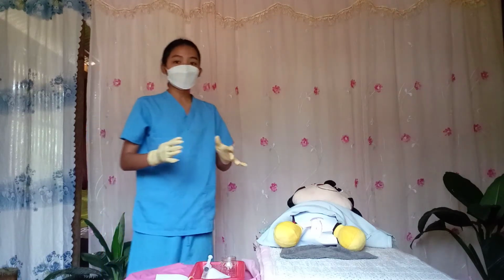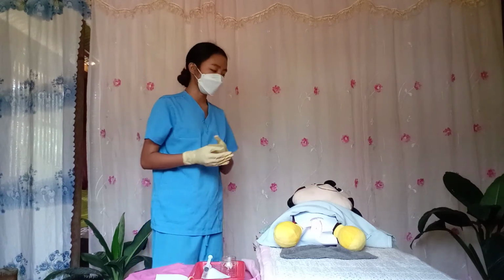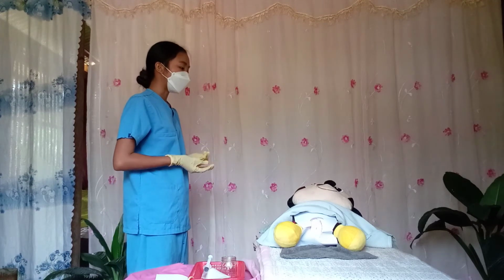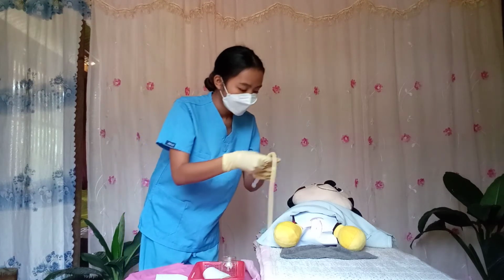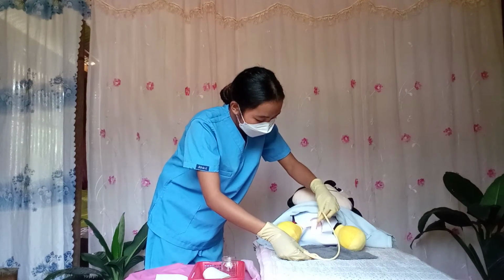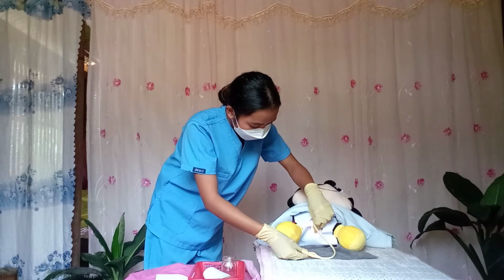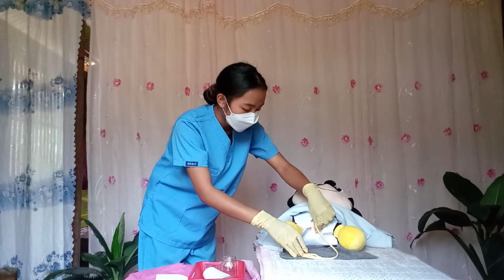Okay, after that, we are going to insert it in the urethra of the patient. So ma'am, I am now going to insert the catheter in your urethra, so just be relaxed and take a deep breath. So inhale, and then exhale. Thank you. So insert the catheter for about 2 to 3 inches or until the urine flows out. So I can see now the urine.